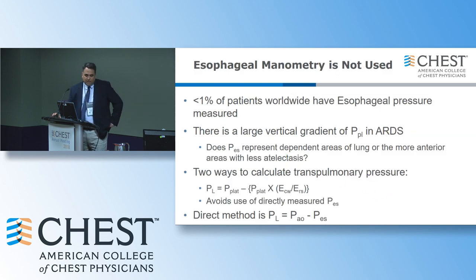So most people in the audience should say, well, geez, can't you show me anything that's not 10 years old at this point? I mean, it is 2018. That was published in 2008. And the fact is that less than 1% of the patients worldwide have esophageal pressure measured for clinical reasons. Why? Well, it's difficult. It's complex. Most clinicians don't use these devices. So there's a little bit of a knowledge gap.